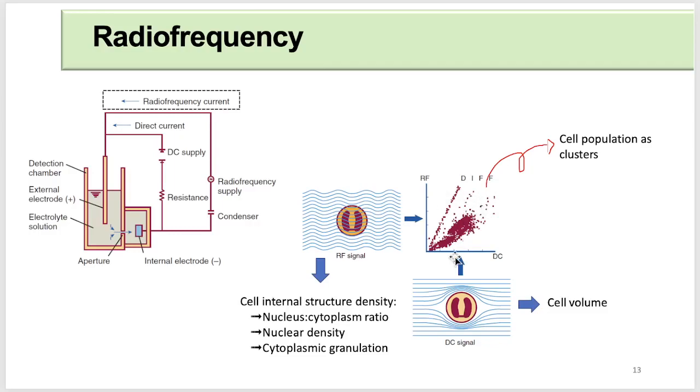So, pag sinabi natin clusters, that's a particular group of cells. Naka-cluster dito, monocyte, naka-cluster dito, lymphocyte, that's a cluster. So, that's another important parameter or property na nakukuha natin. Clustering and the dots representing the number of cells. That's it. As simple as that. Gusto ko, yan lang ang ating thinking. Do not overthink na lang, okay?